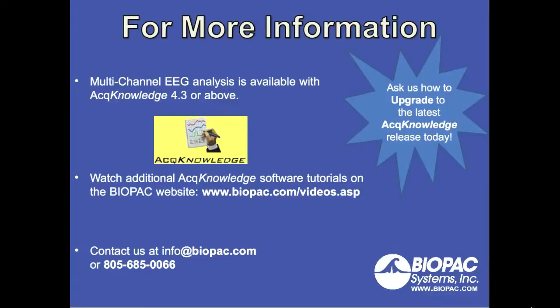Multi-channel EEG Analysis is available with AcqKnowledge version 4.3 or above. You can watch additional AcqKnowledge software tutorials on the BIOPAC website at www.biopac.com. You can also contact us for more information at info@biopac.com or 805-685-0066.